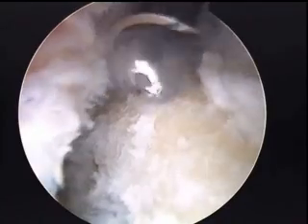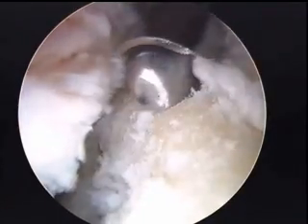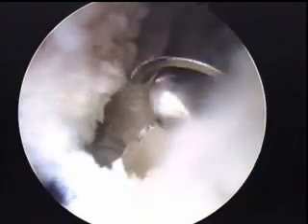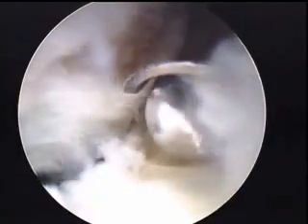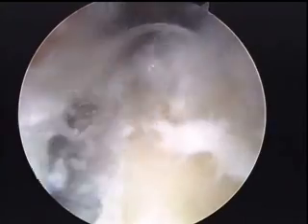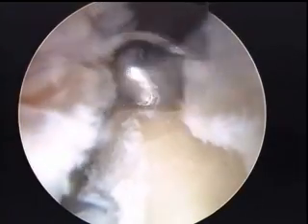Now we're going to bring a high speed burr here and trim off some of the acetabular rim. This is going to do two things: it's going to prevent more impingement in this area and also bring our acetabular rim back to the area where there is better cartilage. Without doing this, we would have to repair the labrum back to his old rim, and in that area there would be a void of good cartilage between the labrum and the normal joint surface.